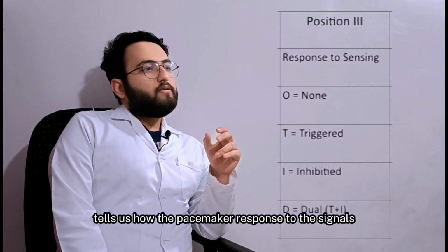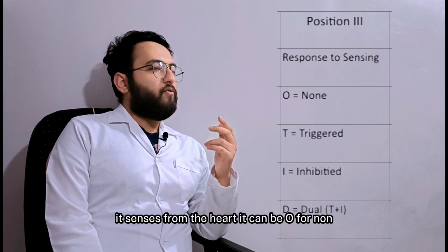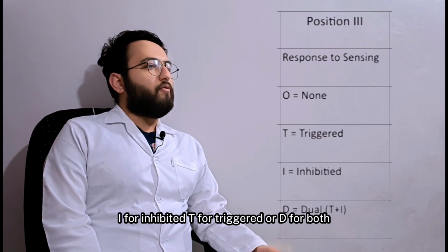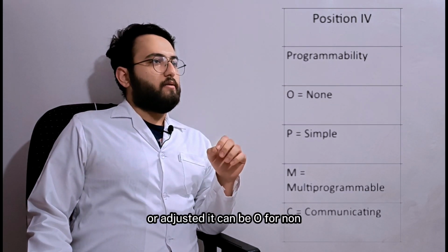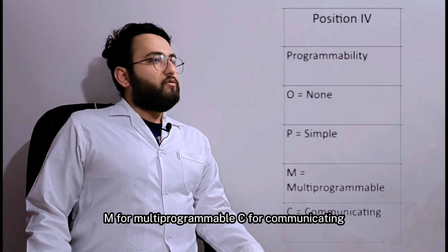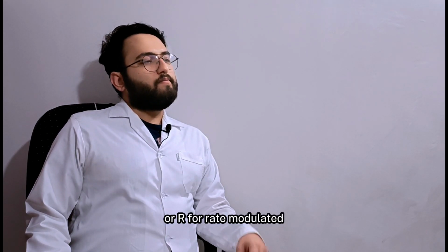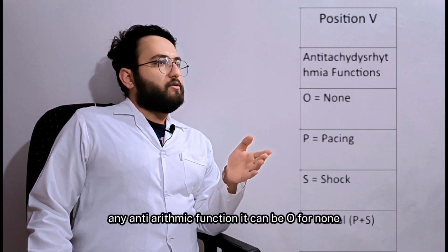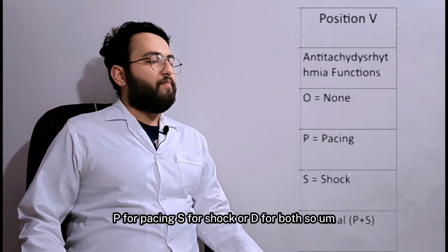The third letter tells us how the pacemaker responds to the signals it senses from the heart. It can be O for none, I for inhibited, T for triggered, or D for both. The fourth letter tells us how the pacemaker can be programmed or adjusted. It can be O for none, P for simple programmable, M for multi-programmable, C for communicating, or R for rate modulated. The fifth letter tells us if the pacemaker has any antiarrhythmic function. It can be O for none, P for pacing, S for shock, or D for both.